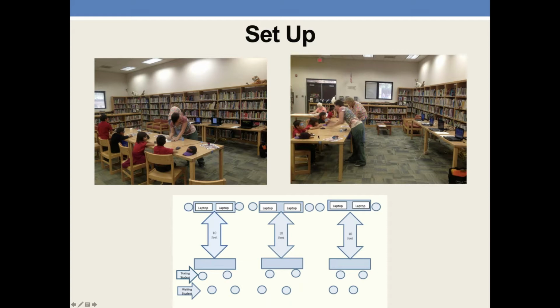But that mouse, it's a wired mouse, and then we provide a 10-foot extension cable. So that white cable, I don't know if you can see it on your screen, is what is plugged into the computer. It's a USB extension cable. That's how the child can sit 10 feet away, because as you know, mouse cables are not 15 feet long. So we provide a 10-foot extension cable, and that's how you also measure this distance precisely from the screen to the child's eyes, 10 feet. So you use that white cable as a measuring stick or a measuring rope, and then you plug it into the computer once you've got the distances set up properly, and you're off to the races.